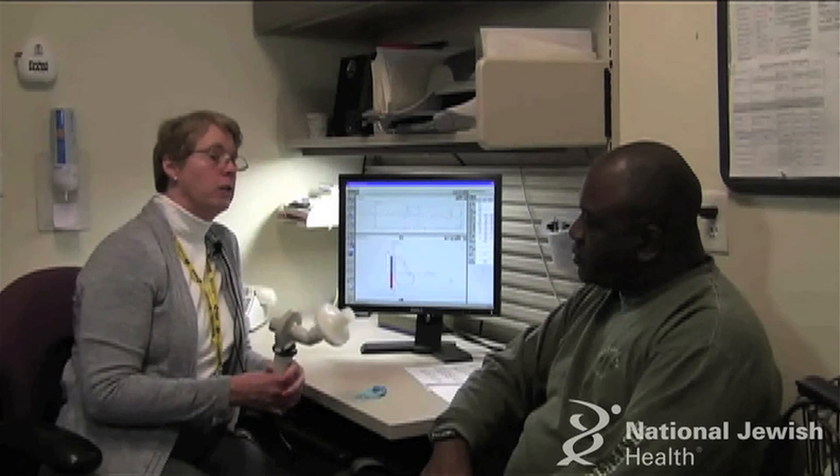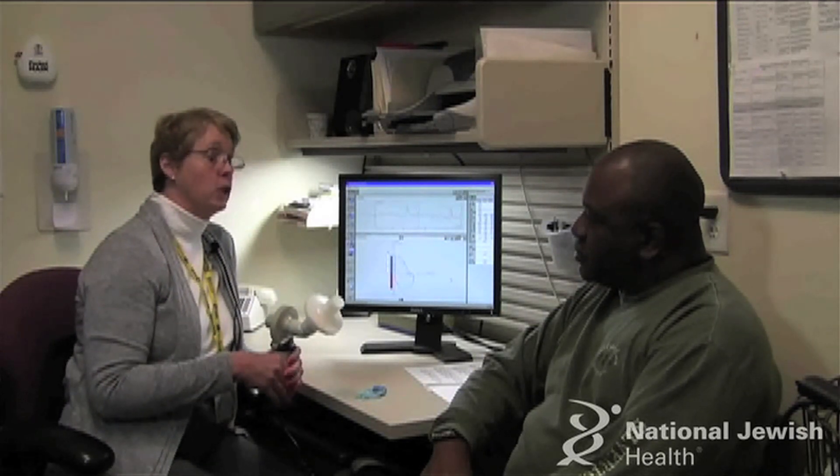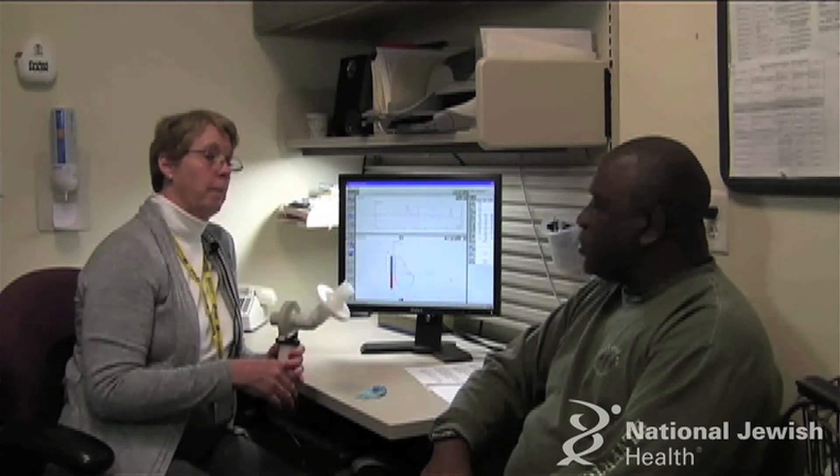Before we do this test I want to make sure there's no medical reason that you cannot take this test today. Have you had any recent chest or eye surgery? No. Okay.